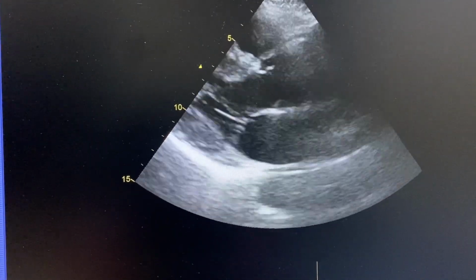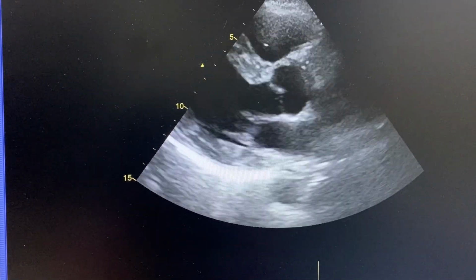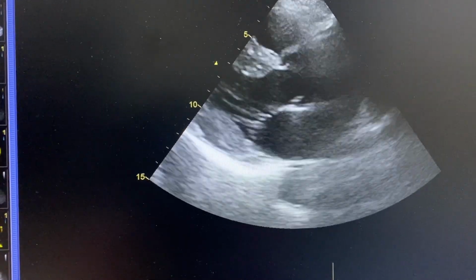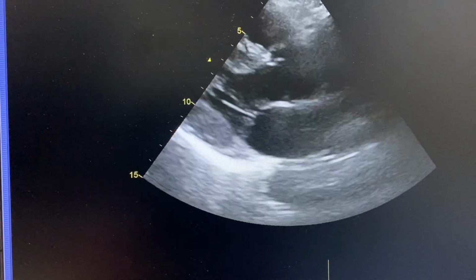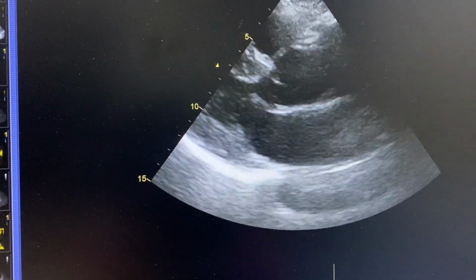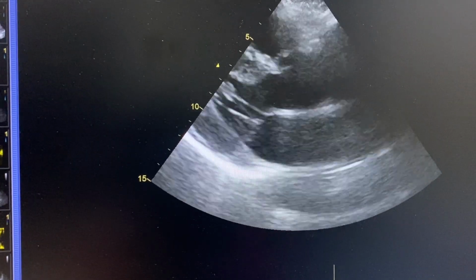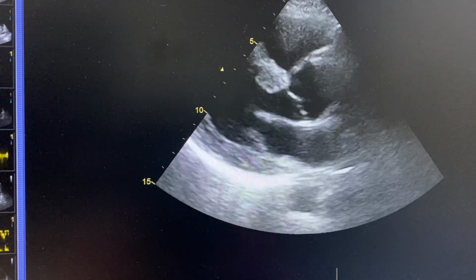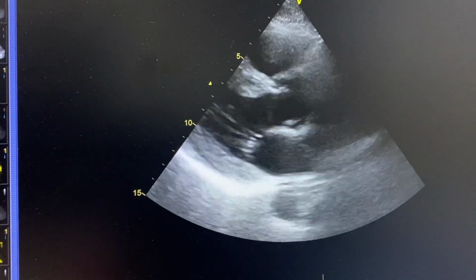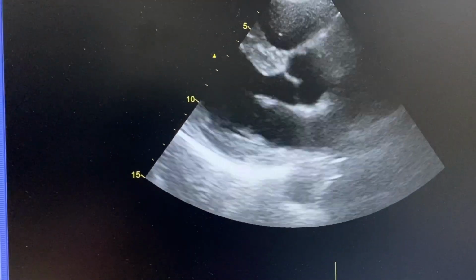Echo is so big that whenever you pass, or whatever structure you see, you have to give it a name, or it has a name. So I'm going to start with one view, then go to another one, until I finish the 17 segments, so that you can actually see them on echo, not the other handwritten or hand-drawn pictures.